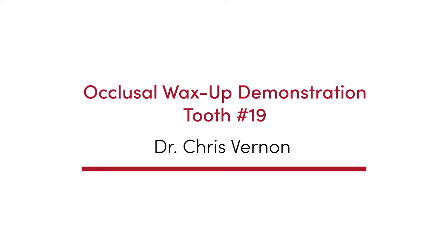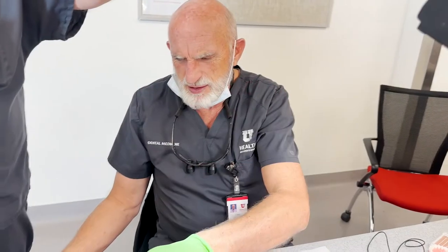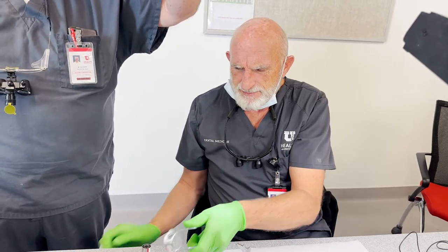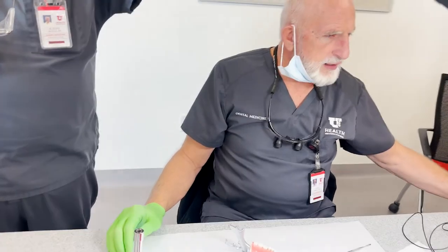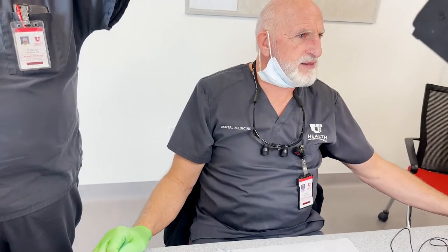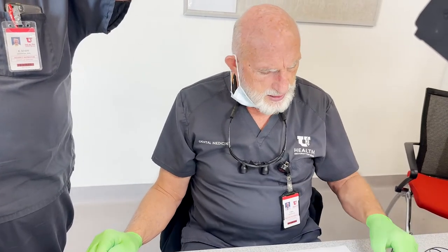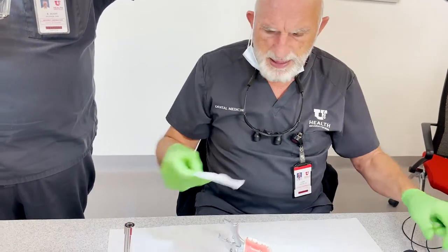We'll start with turning on the Bunsen burner, maybe. Okay, got it going. Now the Bunsen burner doesn't give you the heat that the torches do, so you have to kind of be patient with that.